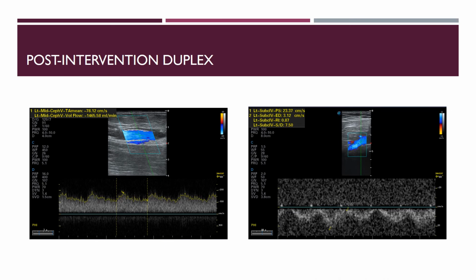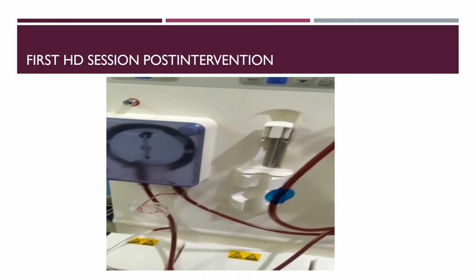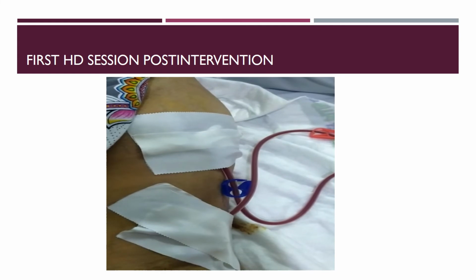Post-intervention surveillance at 1 week revealed a patent, well-functioning fistula, with adequate volume flow and no outflow obstruction. The first hemodialysis session was completed for 4 hours from the fistula on the 7th day post-intervention.